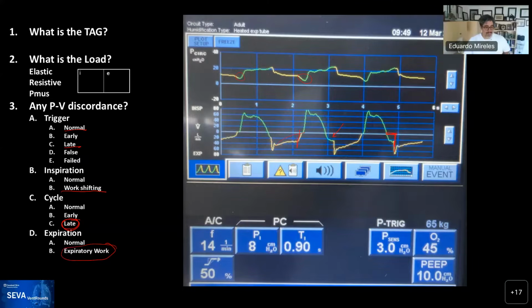I'll put in a paper that describes all that. It's a problem with some ventilators. Yeah, so the ventilator is going to display the area and tell you that that's what the patient inhaled. But this part should be included, and it's not being included. Is that what you're saying, Rob? Exactly.